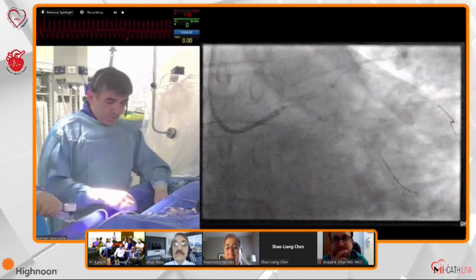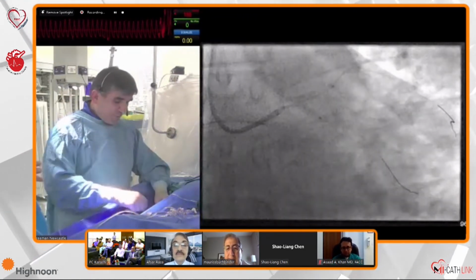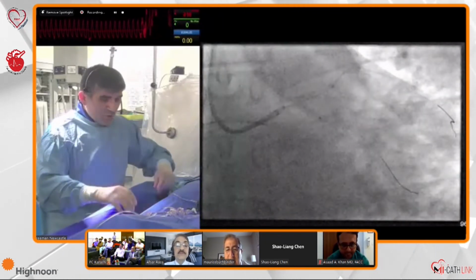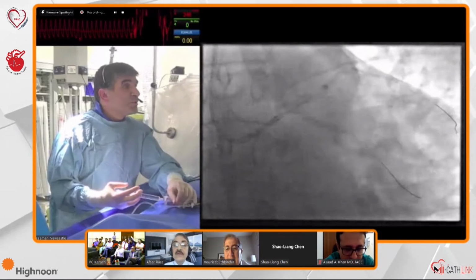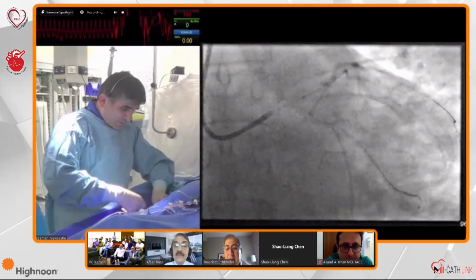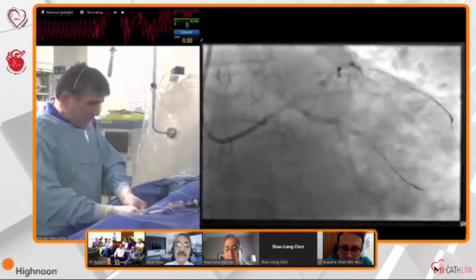What balloon is this? Okay. So the balloon ruptured. Come off negative. The balloon ruptured, so we still have, obviously. We're just going to take a little test to make sure we're good here. Here we go. Perfect. Often they still have a speck of calcium, because the calcium will be fractured now.